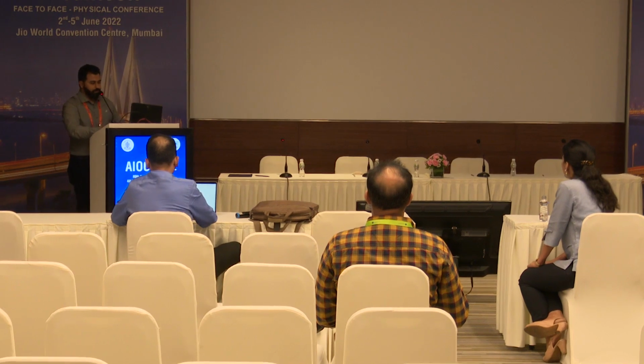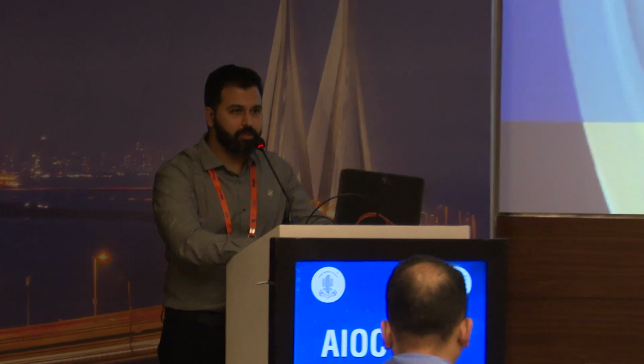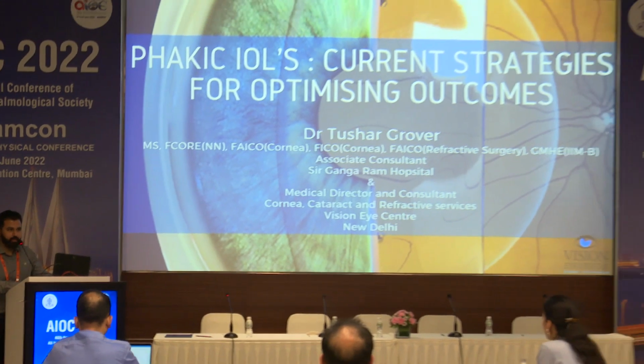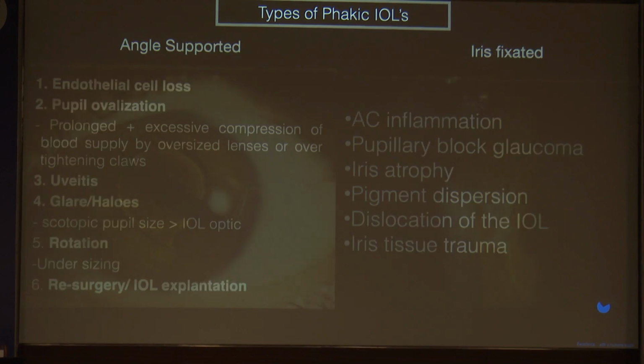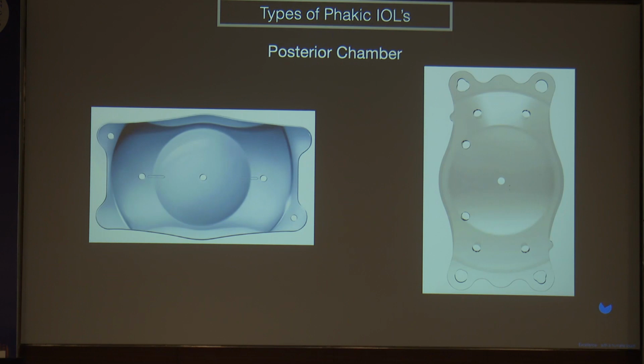So I'll be talking quickly about phakic IOLs. I will not take too much time, and Nikunj has already covered quite a bit about the preoperative workup as well. Starting with the preoperative strategies, we know that there are the angle supported and iris fixated IOLs as well, which we really did not get on to doing too much because of the issues that were associated with it. And what has really caught on is the posterior chamber phakic IOLs.